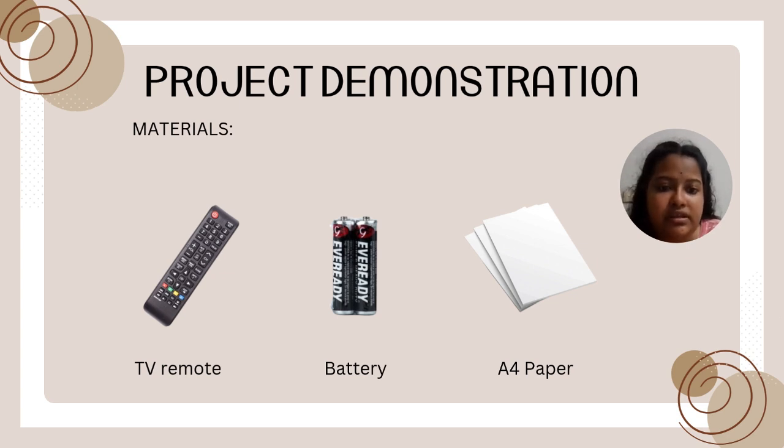This experiment is related to capnography because the capnograph also uses infrared light to detect the carbon dioxide in human breath through the IR absorption principle. In conclusion, this demonstration shows the basic concept of infrared detection and the working principle used in capnography.